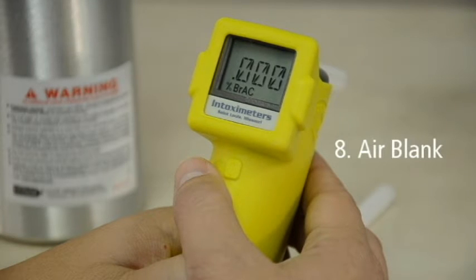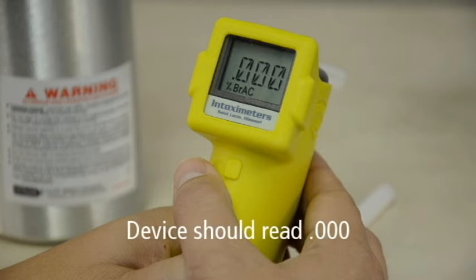This means the device is performing an air blank. An air blank is a procedure that checks the device for any residual alcohol that may remain from a previous test. You will hear a single click sound, then the display momentarily reads the air blank results. The device should read .000 before continuing with the accuracy check.